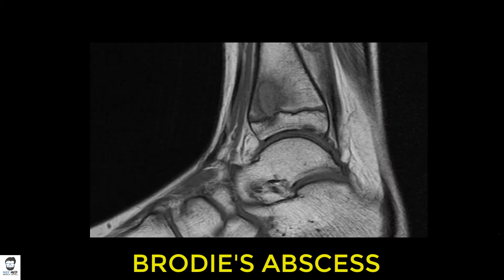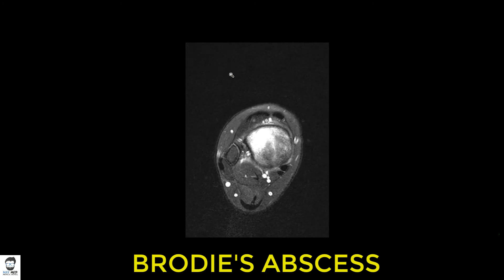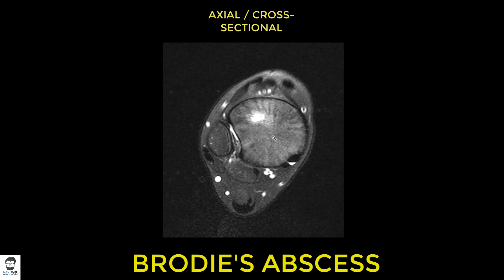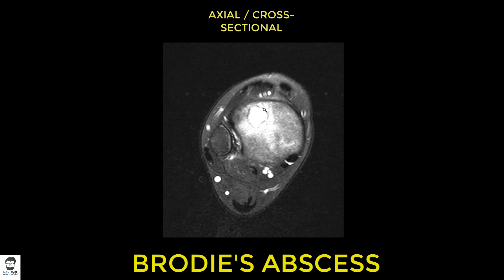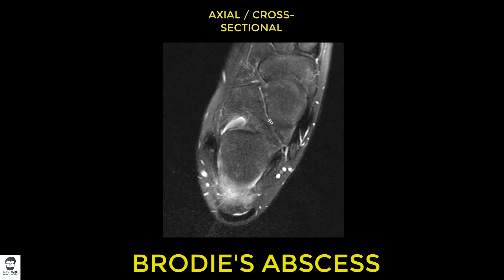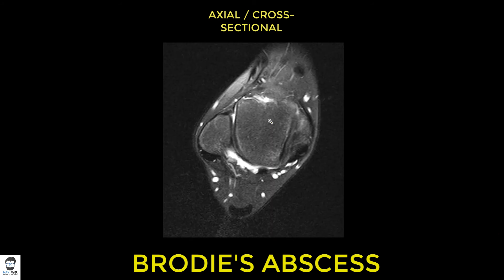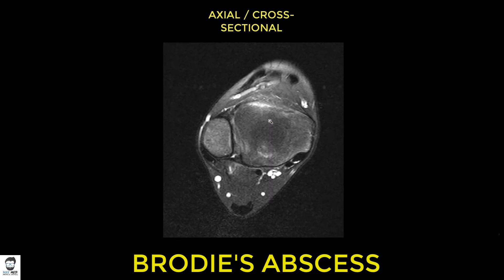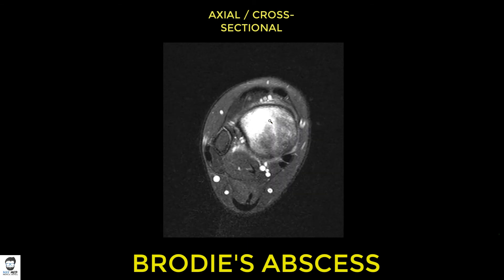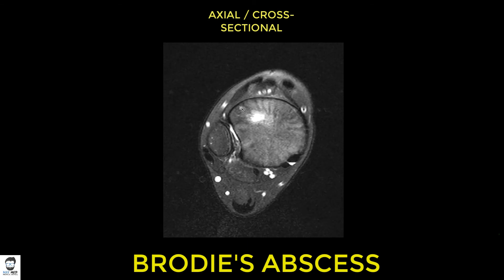Finally, the axial or cross-sectional images show the lesion again as a really well-defined structure with significant periosteal reaction around it. The ankle joint can be seen coming into view. The cortices look very good — there is no breach of the cortices and no major signal intensity changes in the surrounding soft tissues.